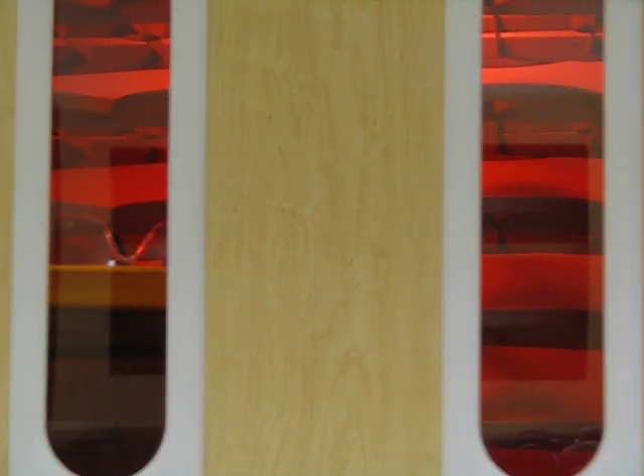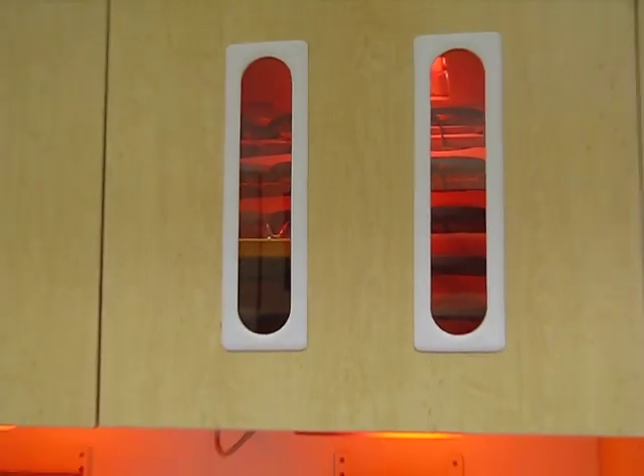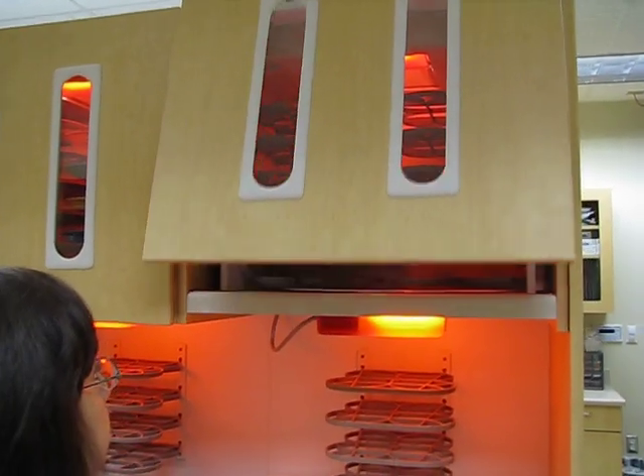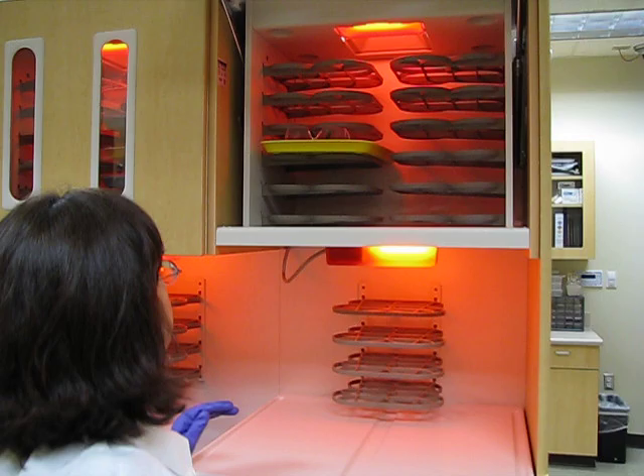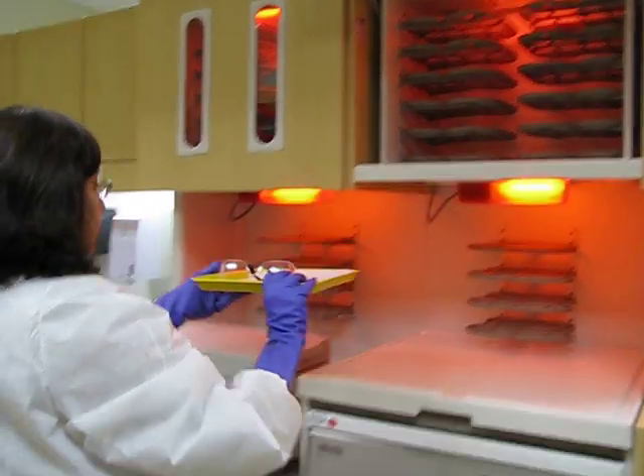This is the sterilization treatment center, part A. We've already cleaned our room, and we come take our dirty tray and our instruments. We're still wearing the utility gloves.